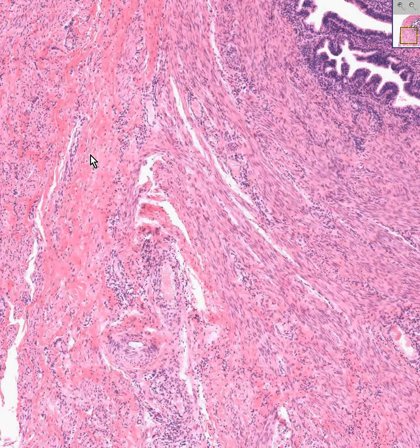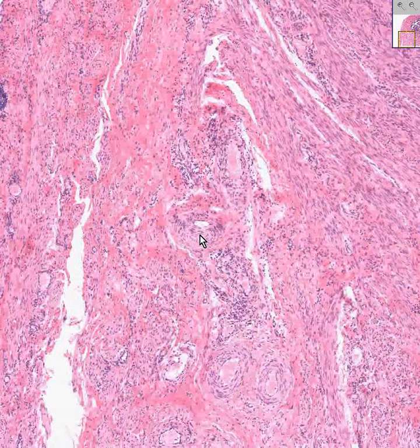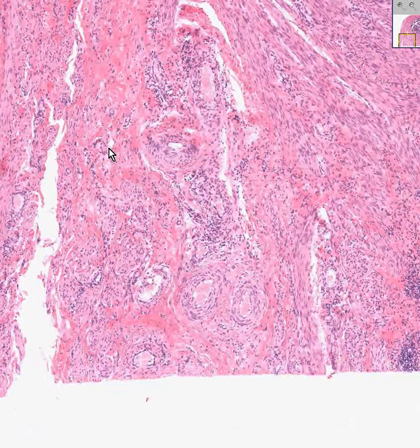So because I am an expert and I don't have to do trichrome stains, I could do trichrome stains in my mind. We have here some collagenous connective tissue consisting chiefly of fibroblasts, whereas the same type of tissue here, which is not quite as pink, is basically an array of smooth muscle fibers cut in here, perhaps circularly, perhaps in other areas like here, perhaps longitudinally. We have the same type of smooth muscle here in some of these larger blood vessels surrounding the fallopian tube.